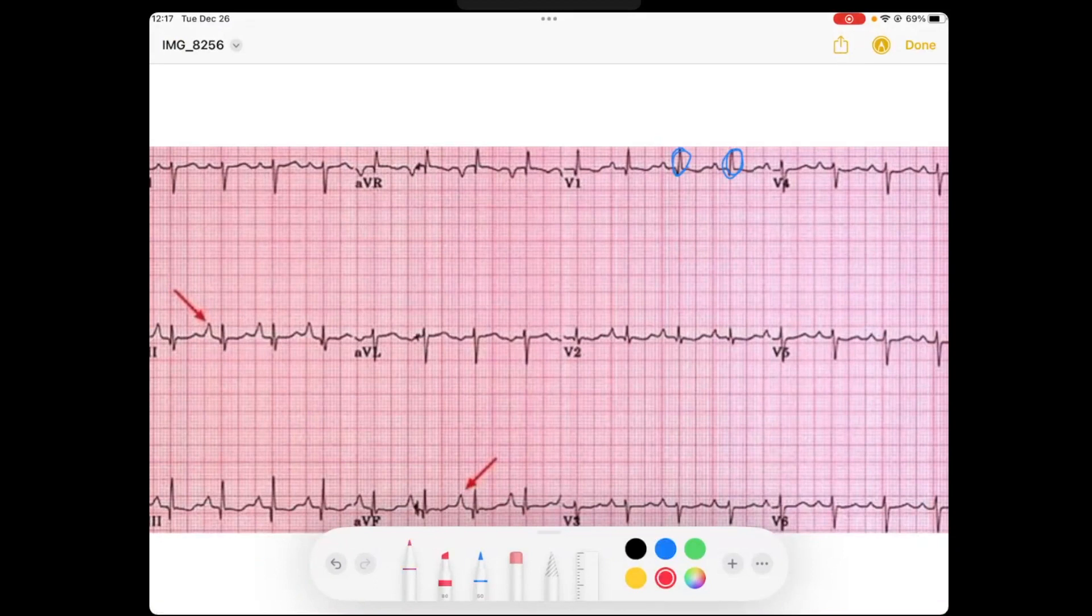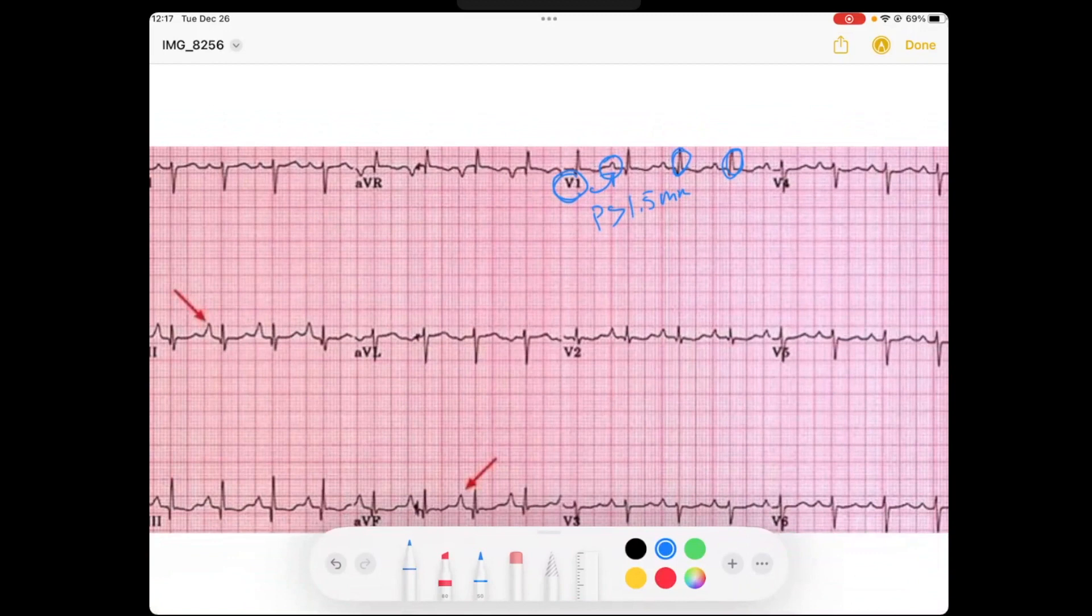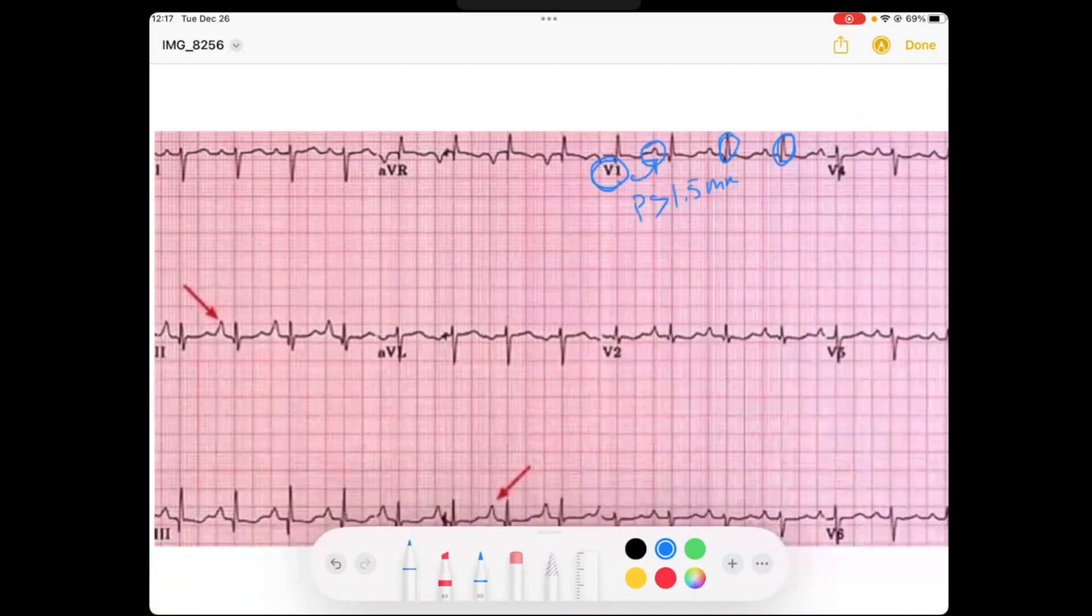And so remember I said that you could look at leads V1, and you could look to see if the P-wave is greater than 1.5 millimeters in amplitude. Here it's very close. I would say maybe not quite.